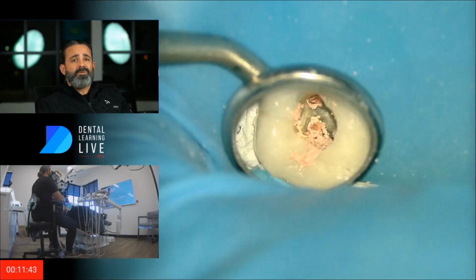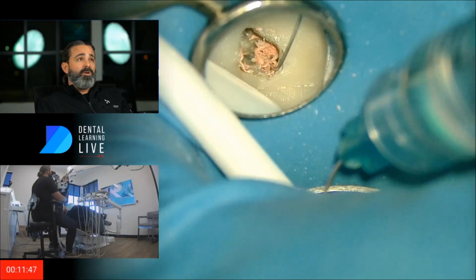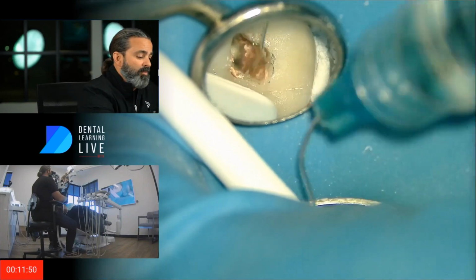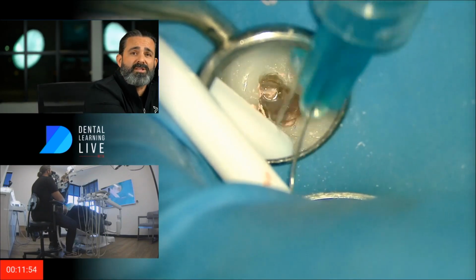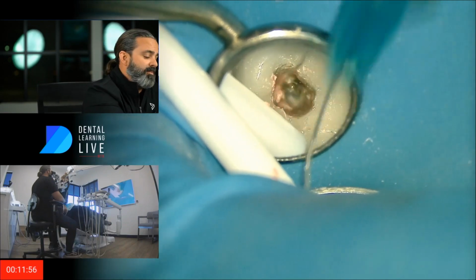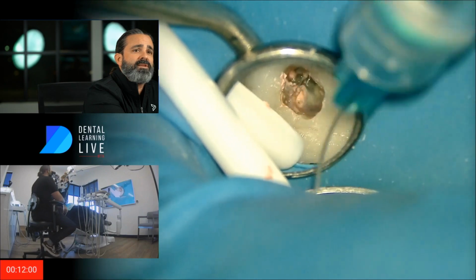And then we'll just get going. And it's just going to be apply and repeat, and go around. And so I won't bore you with the time it takes to clean that out, but I am going to show you some of the struggles that I had in cleaning this out. But I'm going to fast forward this. I'm not going to edit it so you guys can see everything in real time.